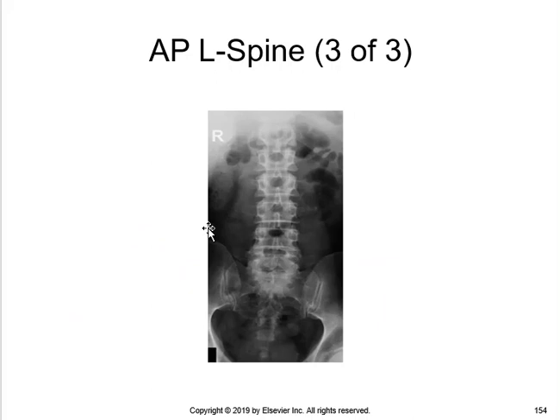And what that means is that the blockiness of those vertebrae, a portion of the vertebra, are going to be at odds with the divergent central ray. So some of the intervertebral disc spaces are going to be kind of going that way, while the central ray is kind of going this way. And I'm drawing that rather exaggerated. But with a patient in a PA projection, if they're laying prone, then those same disc spaces are going at an angle that's more parallel with the divergent central ray.